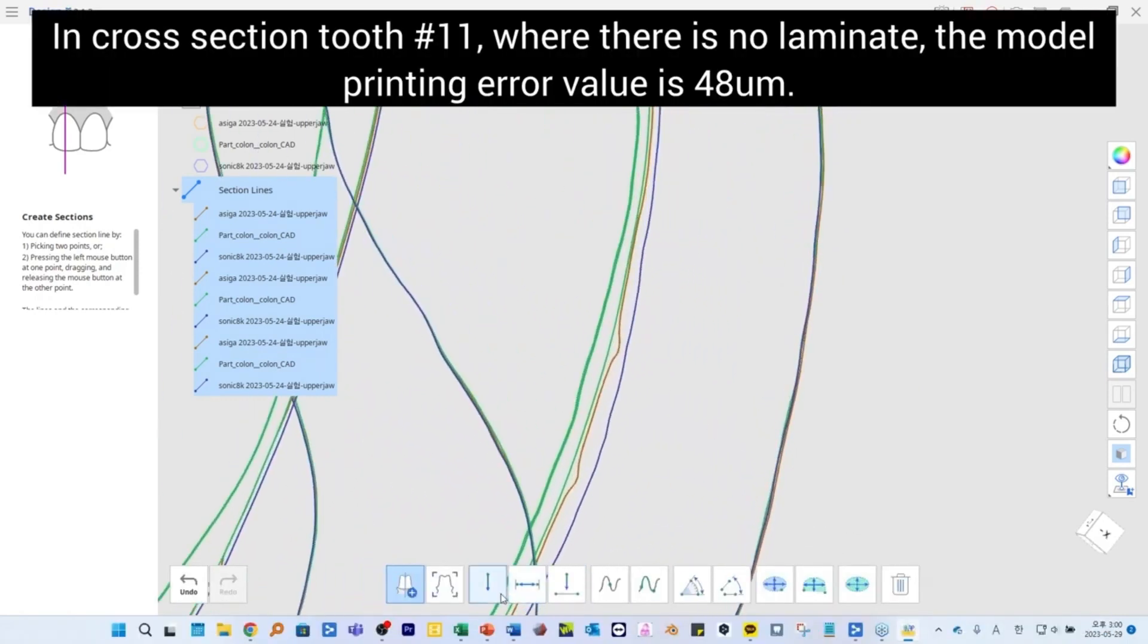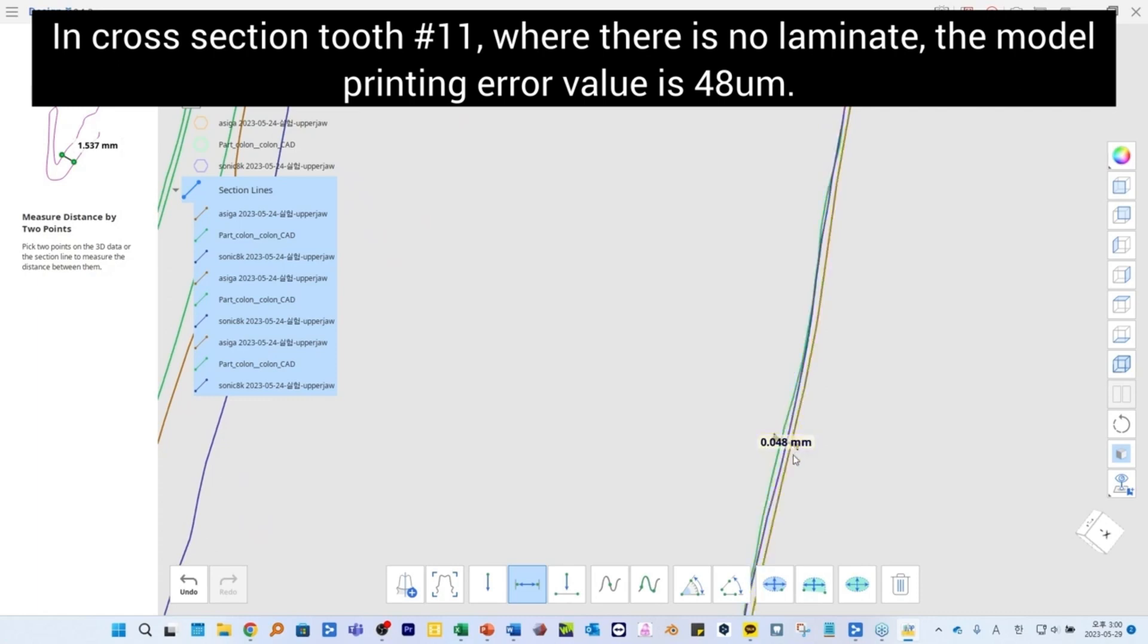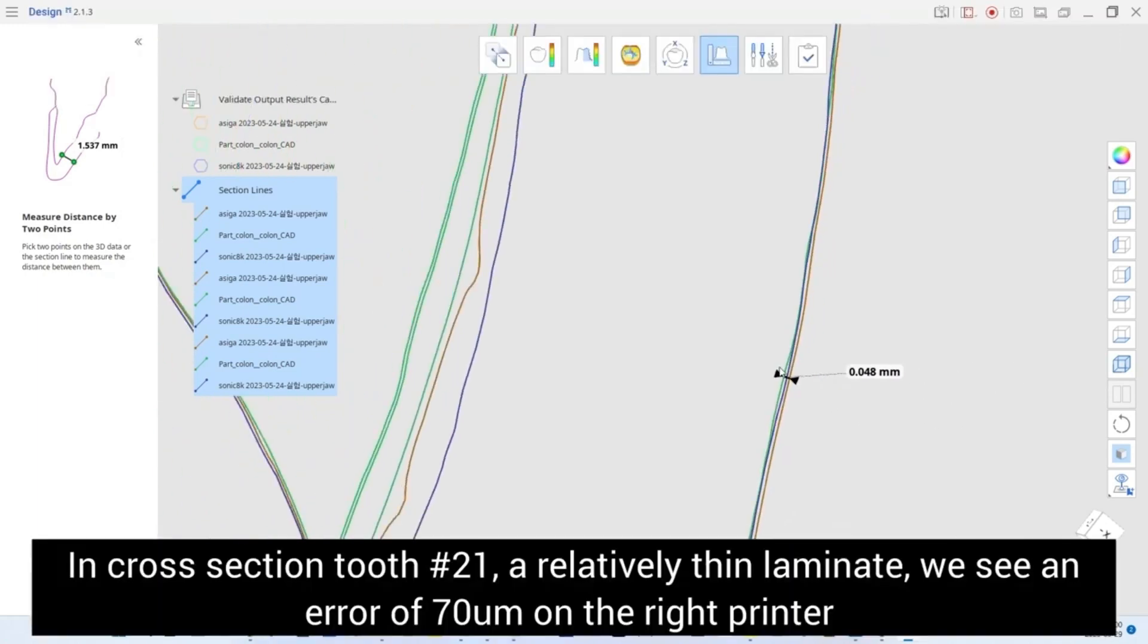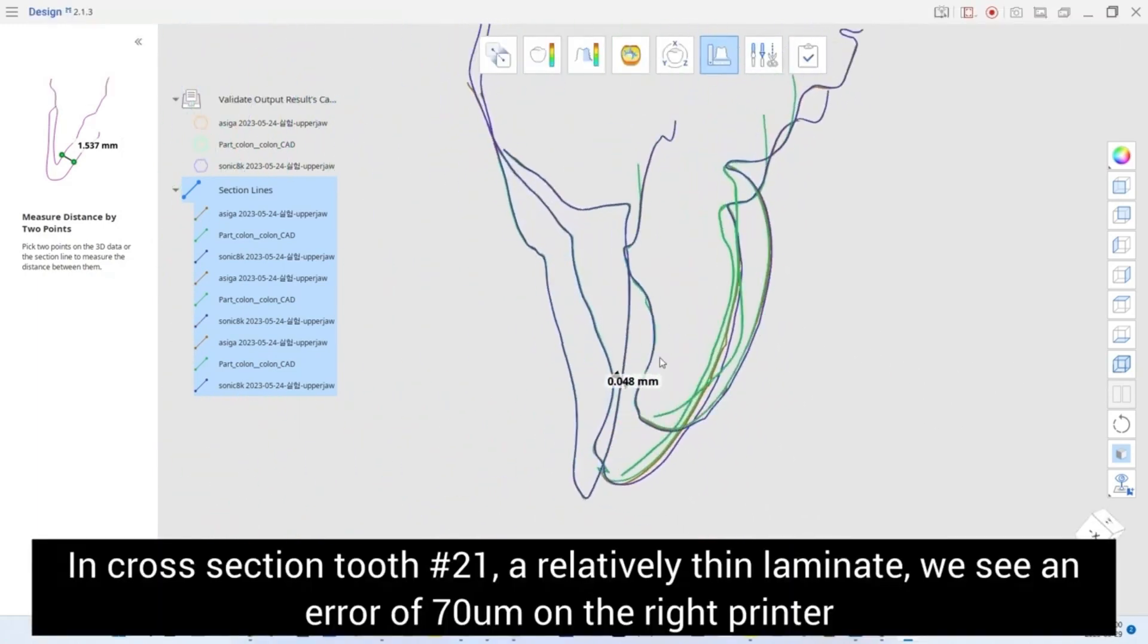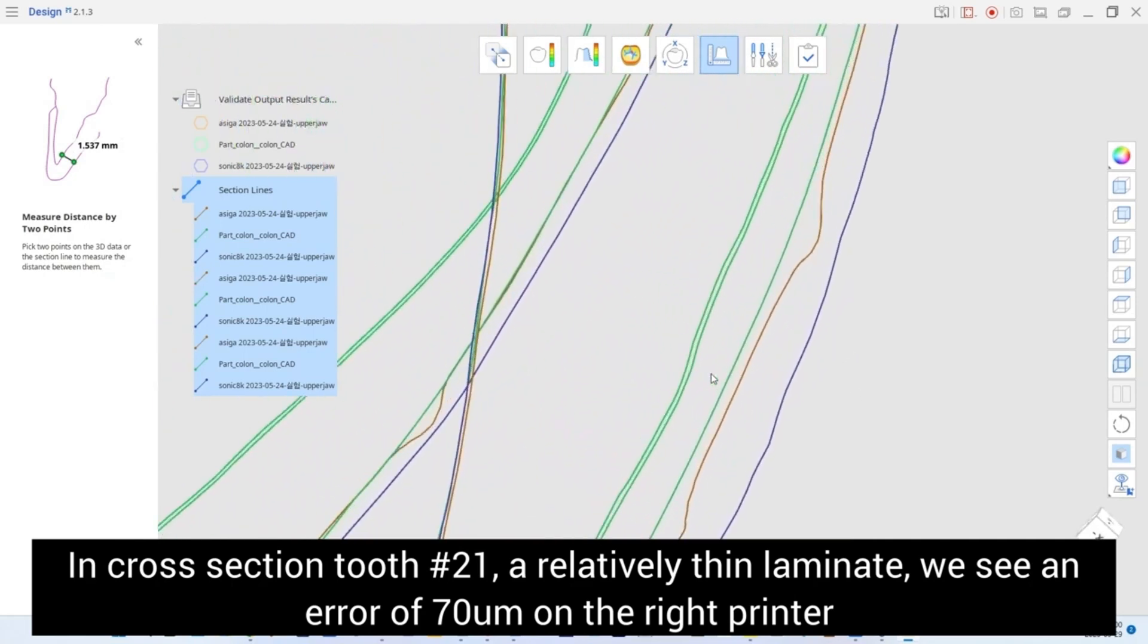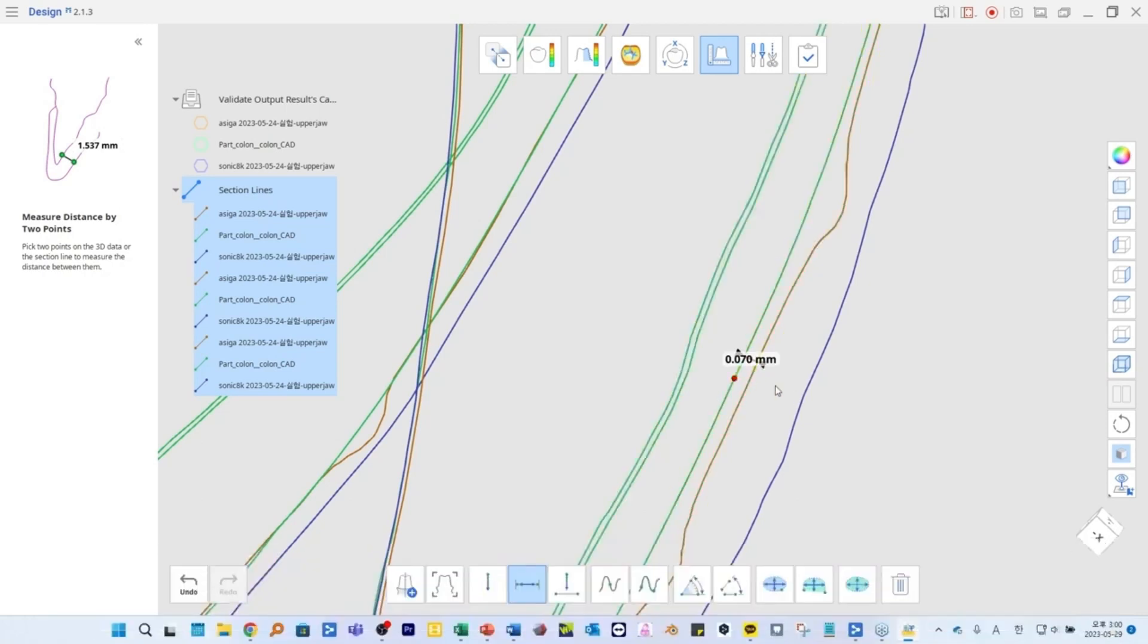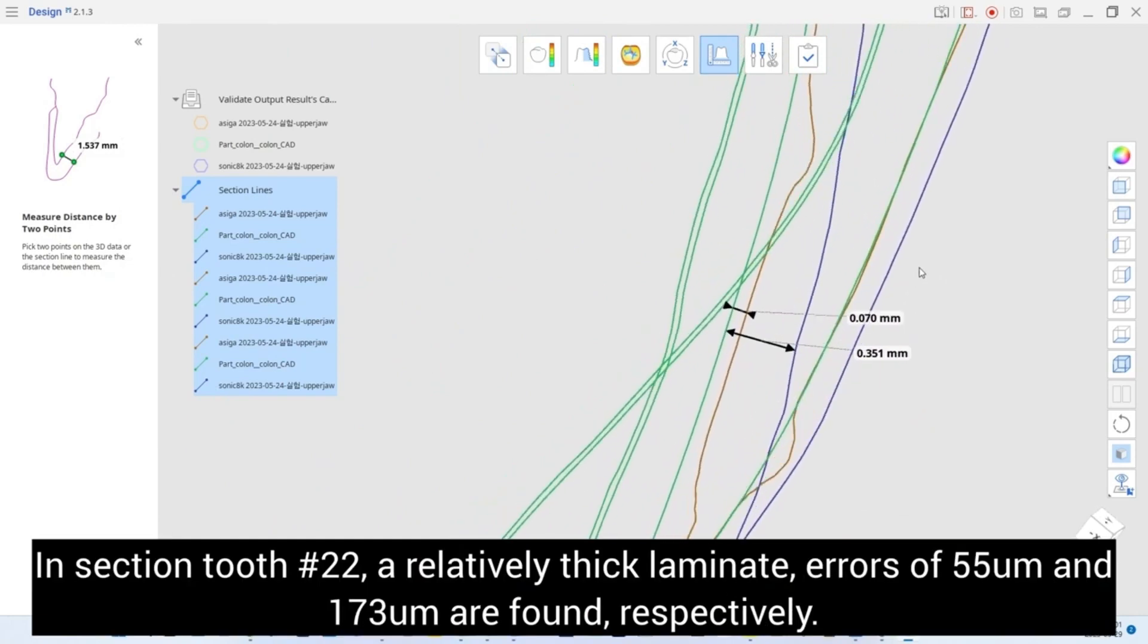In cross-section tooth number 11, where there is no laminate, the model printing error value is 48 micrometers. In cross-section tooth number 21, a relatively thin laminate, we see an error of 70 micrometers on the right printer and 351 micrometers on the left printer.